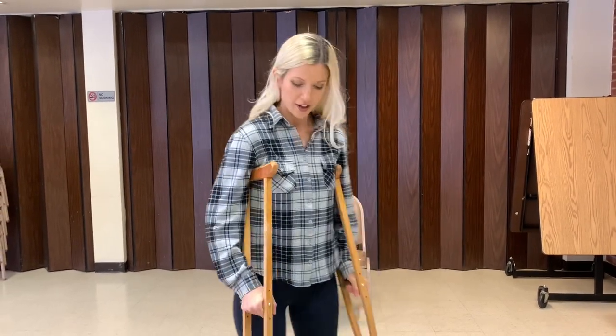Okay, so when you are adjusting crutches for your height, you want to stand up straight, and the top of the crutch should come about 2 to 3 finger widths or 1 to 2 inches from the armpit. They should not be pushing up into the armpit, and you should never lean down onto them like this, because that can cause nerve damage as well as pain when you're using your crutches. So when you're using crutches, your weight is going to be supported in your hands and your wrists. And so you want to make sure your crutches are fitted comfortably.